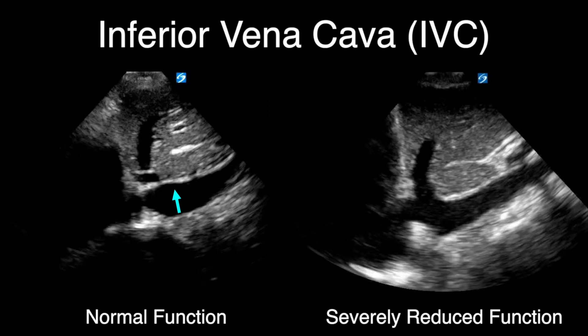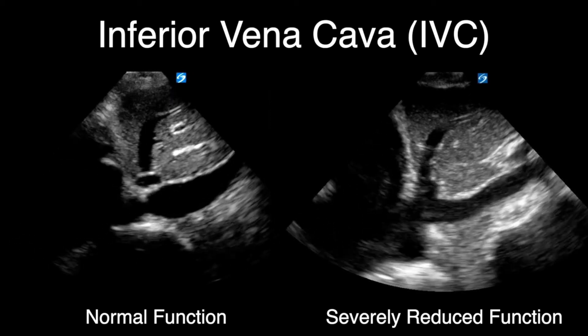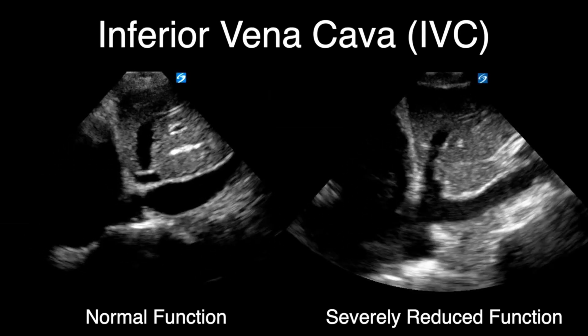The IVC does not always reflect what the heart is doing — CVP does not always correlate with cardiac function. In the severely reduced EF patient the IVC shows approximately 50% collapse with inspiration, while the normal functioning patient's IVC does not collapse much, indicating elevated central venous pressure. You are assessing respiratory variation in IVC diameter, not compressibility. This can be eyeballed rather than formally measured.